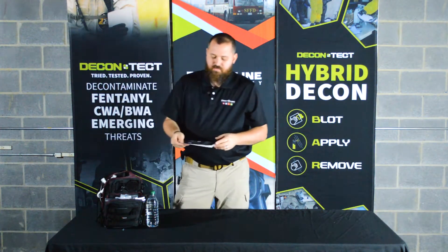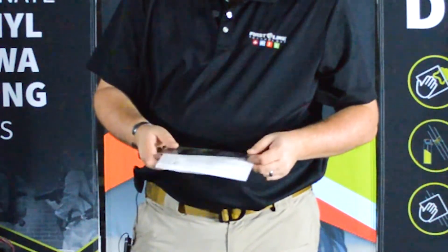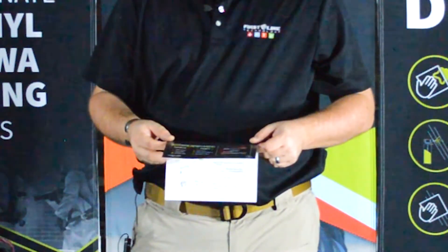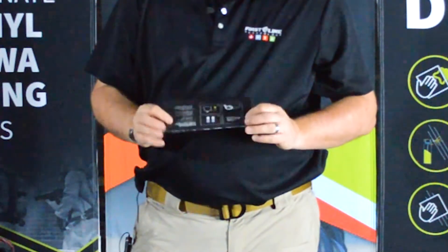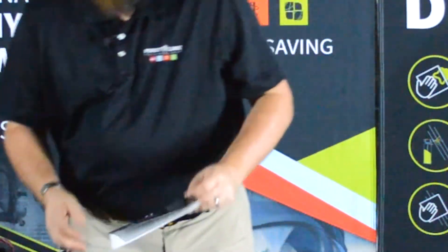There's an instructional card that comes with every kit. It's got some basic information on the front about basic safety and PPE required for synthetic opiates like fentanyl and carfentanil. On the inside, it's the procedure and how to use the kit. And on the back side, we actually have evidence collection and testing procedures for fentanyl. I'll go into that a little later.